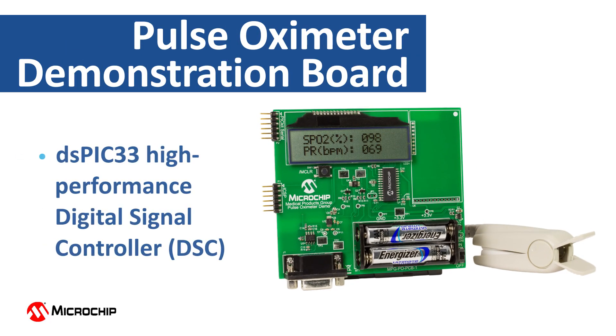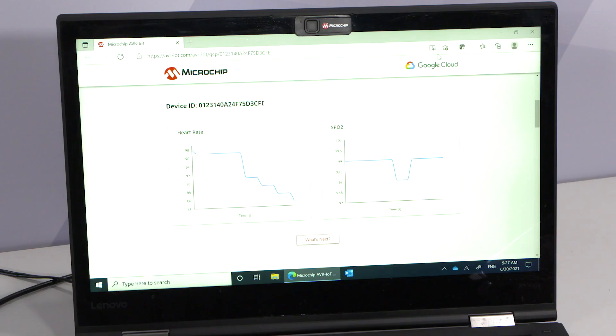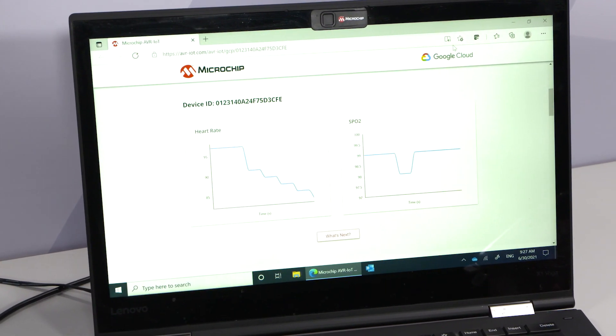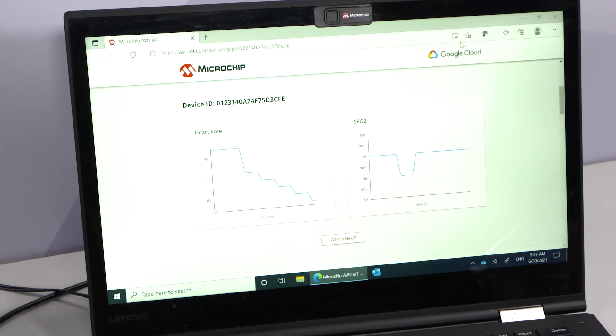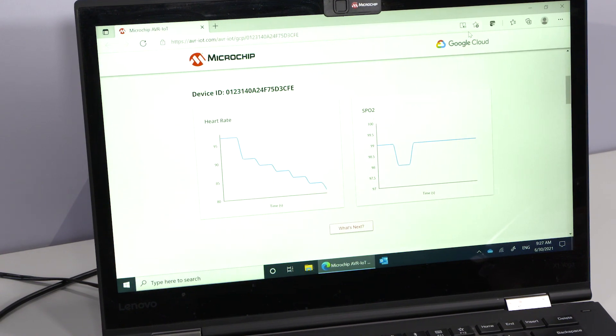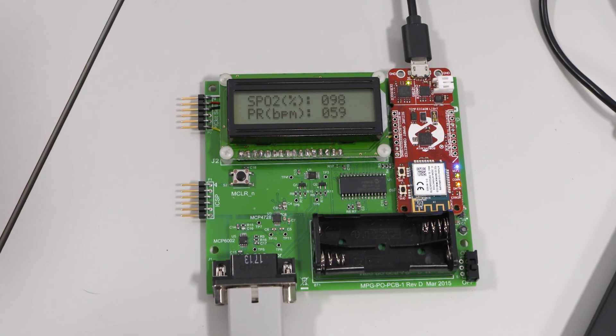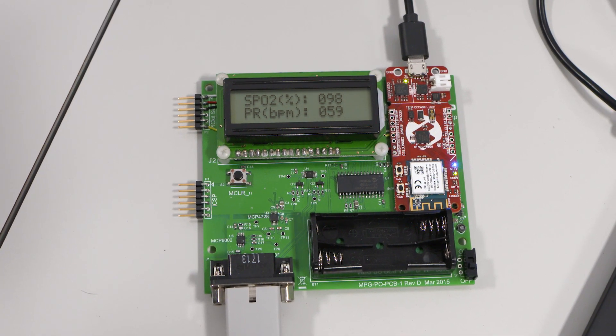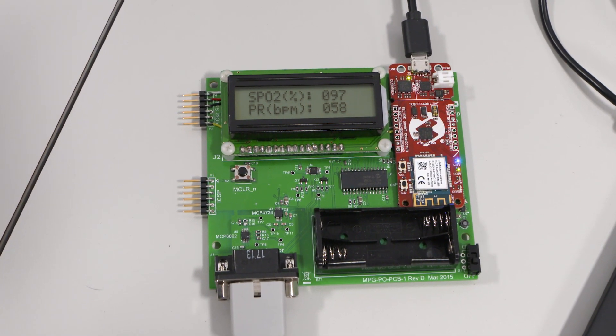The Microchip Pulse Oximeter Demo Board was implemented using a Microchip DSPIC33 High Performance Digital Signal Controller, or DSC. The DSC implements a 513th order Digital FIR Bandpass Filter. This filter function, along with the rest of the demo design, eliminates the need for an expensive analog front-end part traditionally used in a Pulse Oximeter, and can significantly lower the overall bill of materials cost of your Pulse Oximeter design.